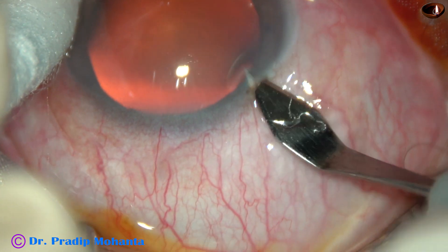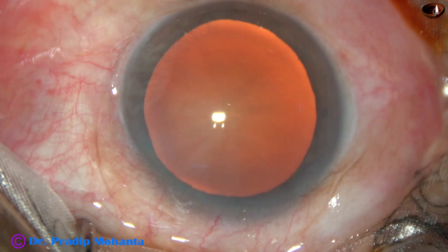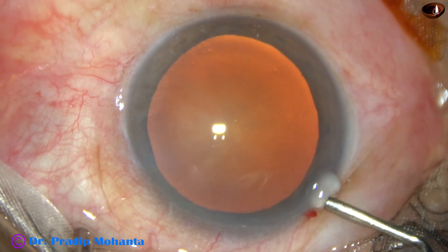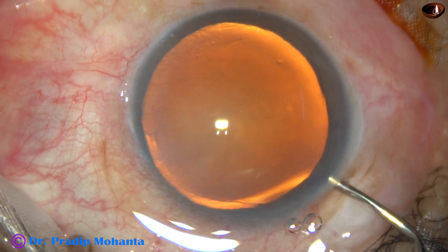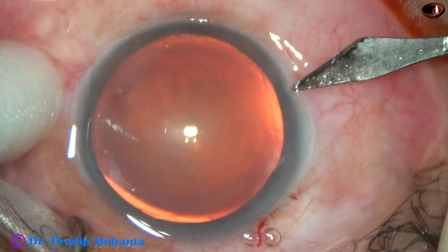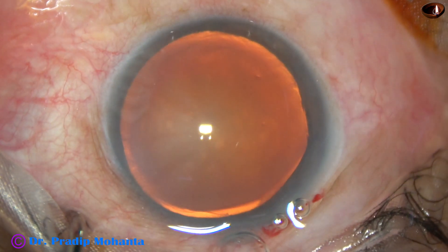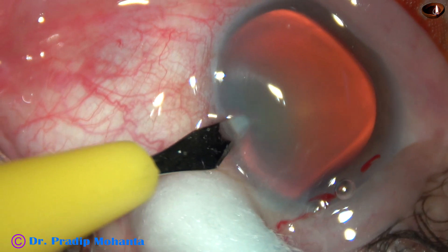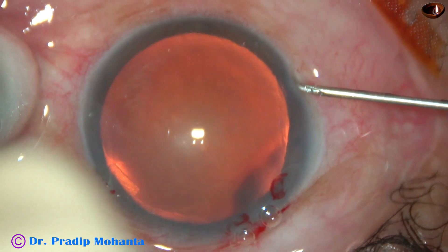This is the main incision at 135 degrees with a steel keratome on the posterior aspect of the limbus. Now this is 2% hydroxypropyl methylcellulose filling the anterior chamber. This is a side port 2.5 o'clock hours away from the main incision, and this is another side port on the left side 2.5 hours away.